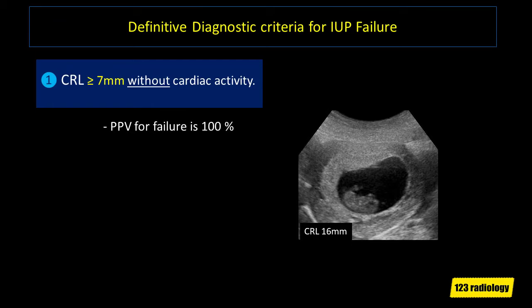This is the first definitive criteria for pregnancy failure: a crown rump length of 7 mm or more without cardiac pulsations, with a 100% positive predictive value. As you can see on this image, there is an embryo measuring about 16 mm in crown rump length; however, there is no visible cardiac pulsations, denoting definitive pregnancy failure.